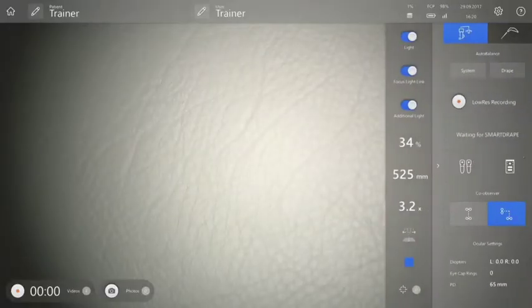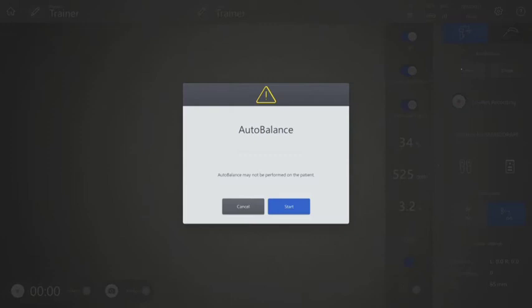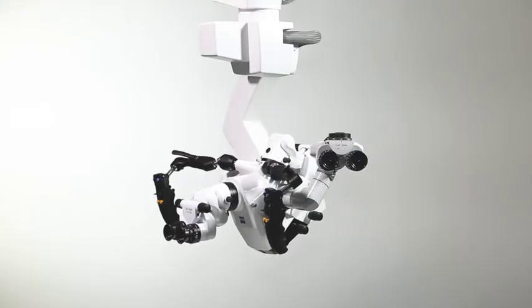Ensure that the device is balanced. To balance the device, simply press the button on the user interface. The device balances itself along all three axes, enabling easy movement during surgery.